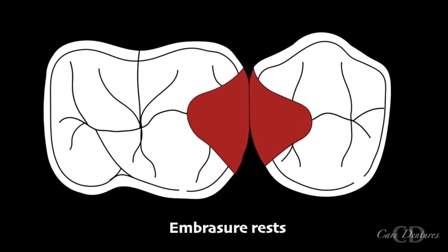Now, there are times when rests are joined together along adjacent abutment teeth. These lie within the occlusal embrasures of adjacent teeth and rest upon a MO and a DO seat prepared together. The embrasure rest seats should be sufficiently deep and adequately wide, especially at the facial and lingual embrasures. Lack of preparation, my dear friends, usually fractures this type of rest in function.